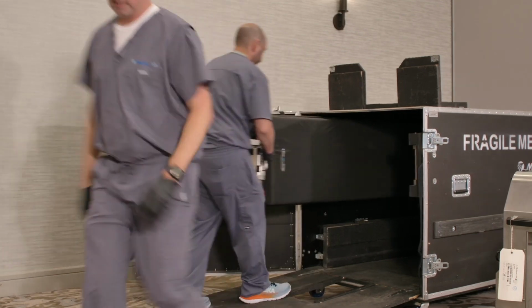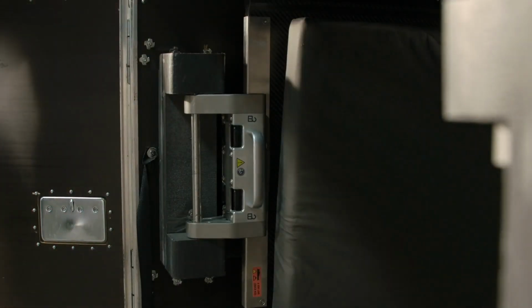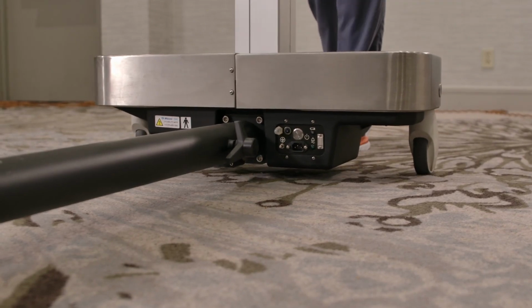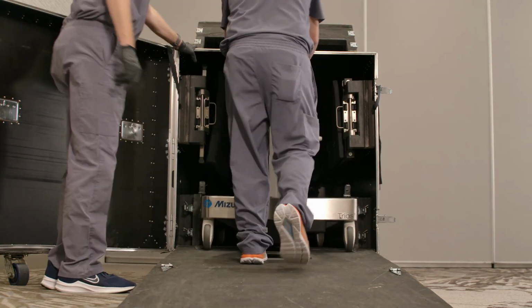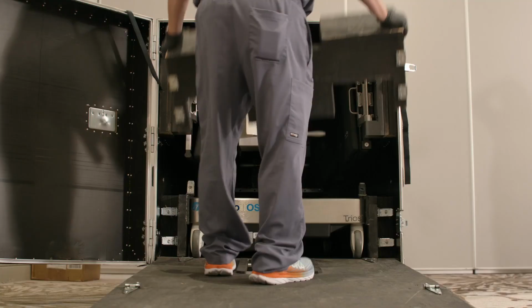You will also have to align the tracks once fully inserted to the crate to make sure that the tabletop is secure for transport. Head back to the Trios table base and then loosen the knob. Now push the table together. Then tighten the knob. Roll the table back into the crate. Grab the table block from the top of the crate and insert into the crate.